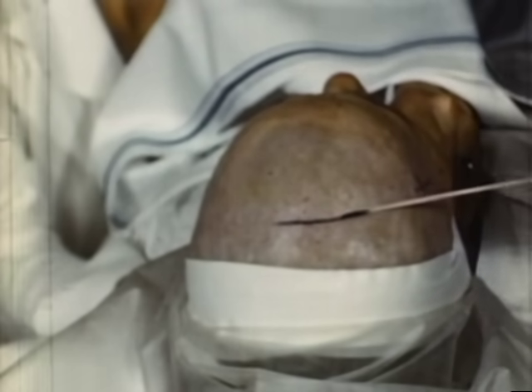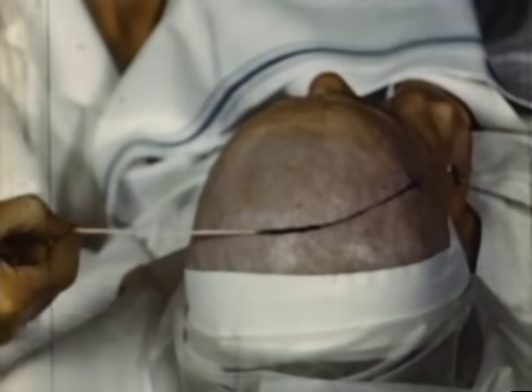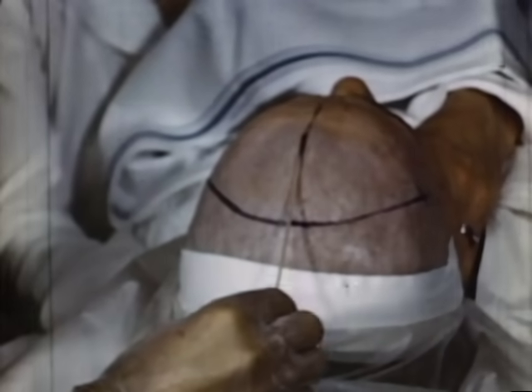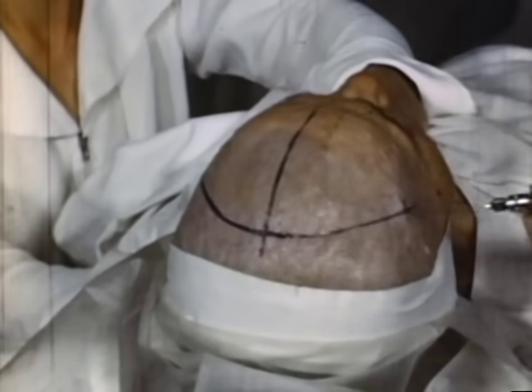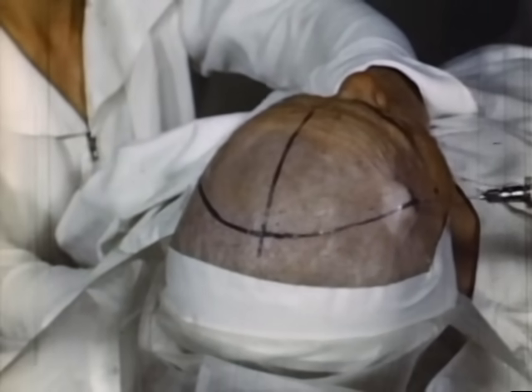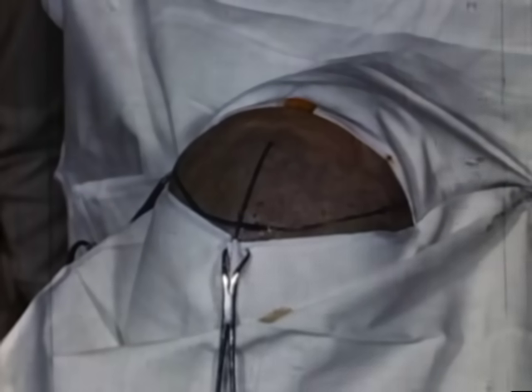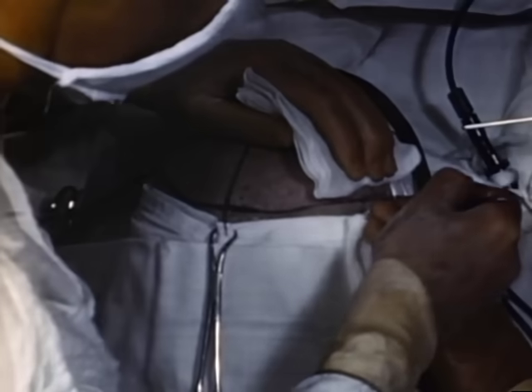These points are joined by a line leading over the vertex, following as accurately as possible the coronal suture. The midline is similarly indicated. Operations can be performed under local anesthesia if the patient is sufficiently cooperative. An incision through the scalp along the indicated line exposes the coronal suture.